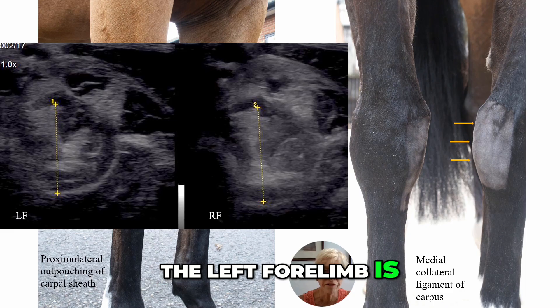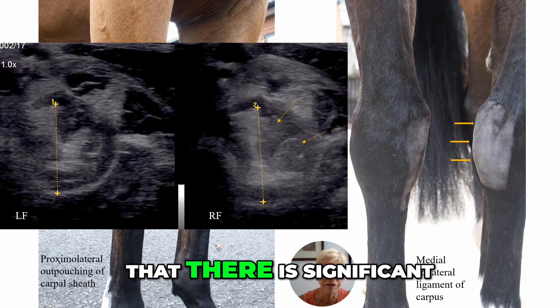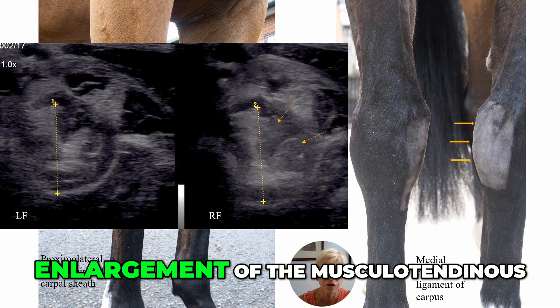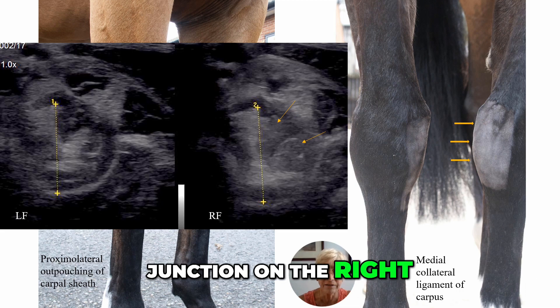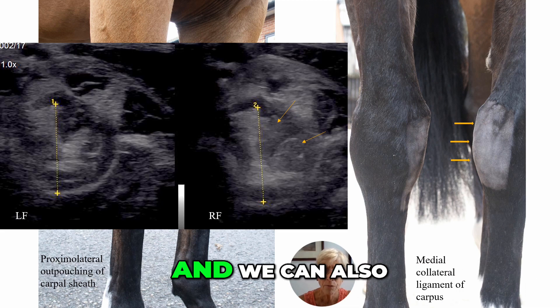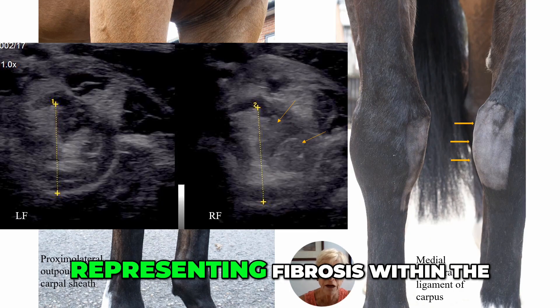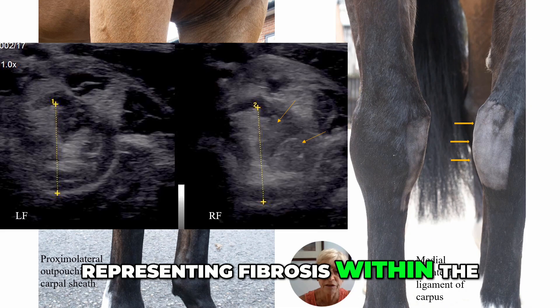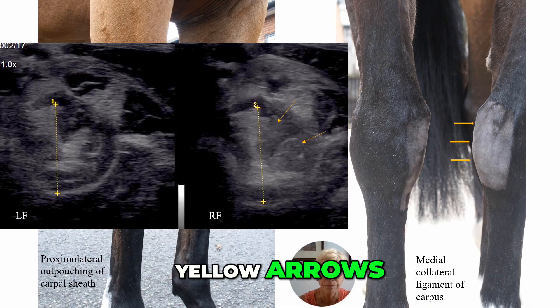The left forelimb is to the left and the right forelimb is to the right. We can see that there is significant enlargement of the musculotendinous junction on the right side compared with the left. We can also see areas of hyperechogenicity, representing fibrosis within the muscle tissue highlighted by the two yellow arrows.